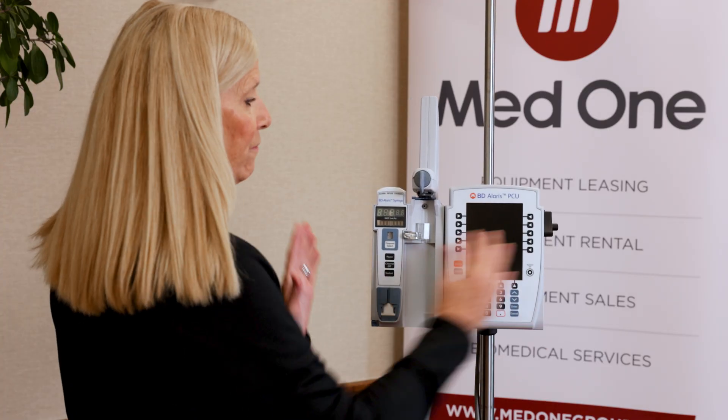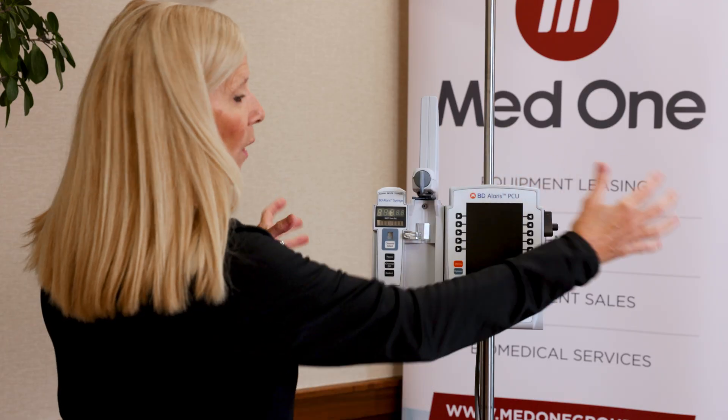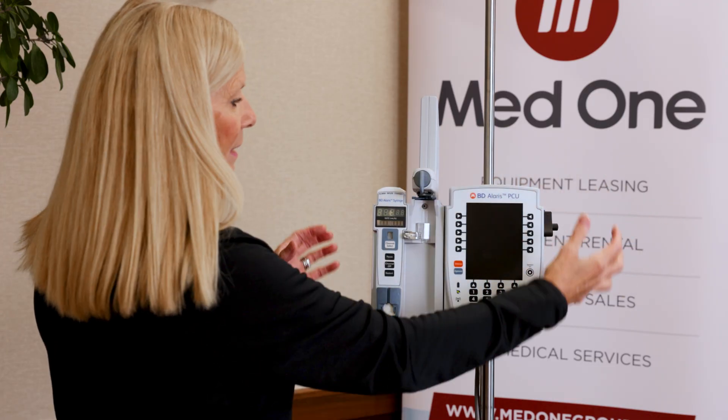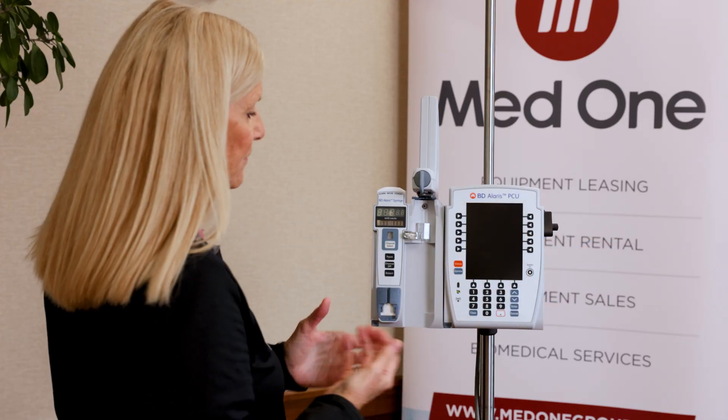You can have up to four syringe pumps per PCU — a quad, triple, double, or single. Mix and match however you want: all four on one side, two and two, just whatever works best for your space.